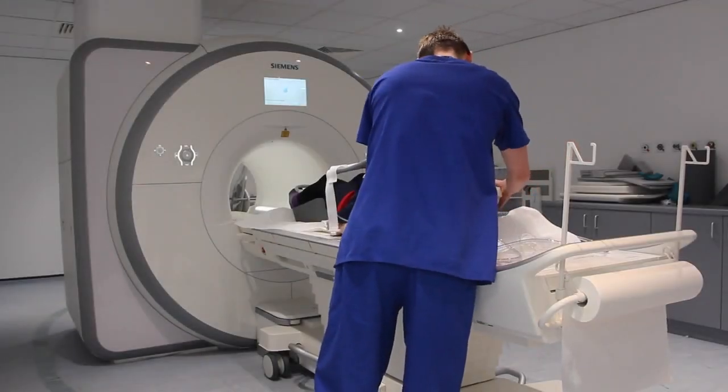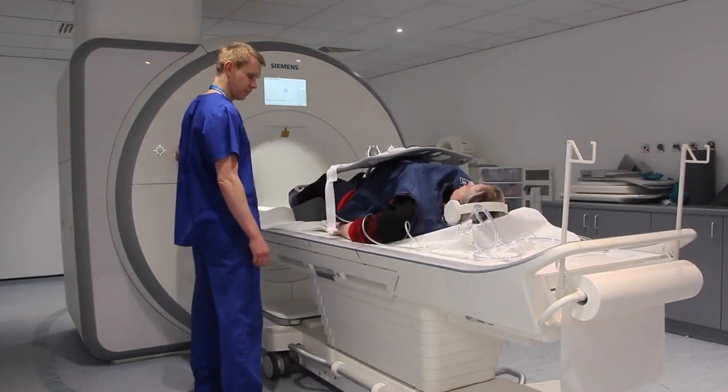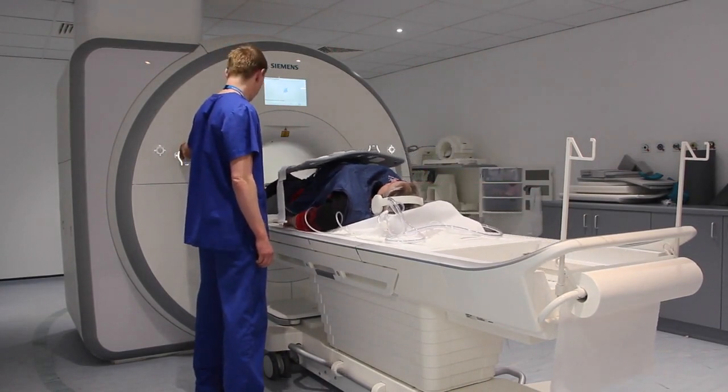Once positioned and comfortable, give the patient noise reduction headphones and advance the table into the magnet bore slowly. Reassure the patient at all times.